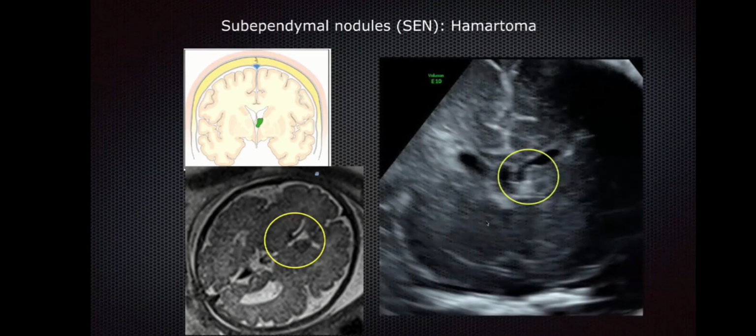And this, you can scan it transvaginally. And this is where I support Gustavo: if you know what you are looking for and you seek what you are looking for, you will find these structures. If you look at them accidentally, there is no chance. And abdominally, no chance to see them easily.